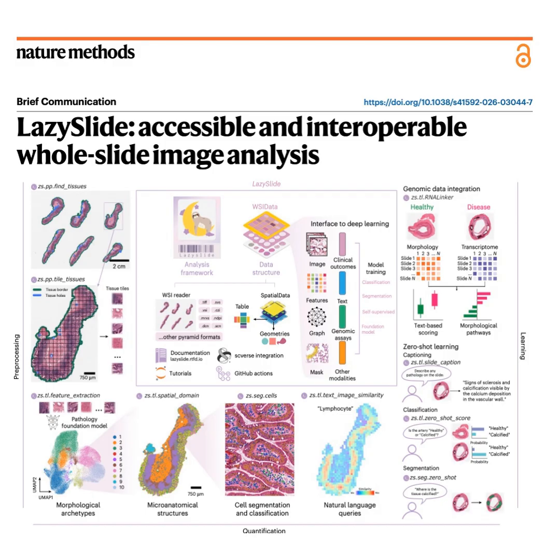Right. They had 24 healthy human arteries and 21 arteries suffering from calcification, which is the buildup of calcium plaques in the vessel walls. And crucially, they also had matched RNA sequencing data for all of these exact same tissue samples. So they started by deploying the text query mechanism we just talked about, right? They fed the slides into the system and just queried the word calcification. Yes. The model calculated the cosine similarity between the text and every single tile on the slide.